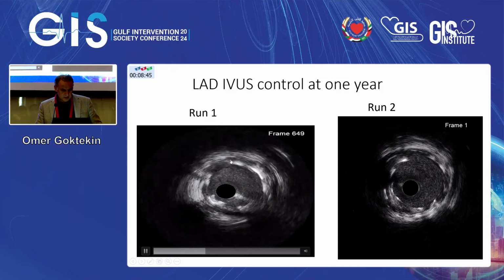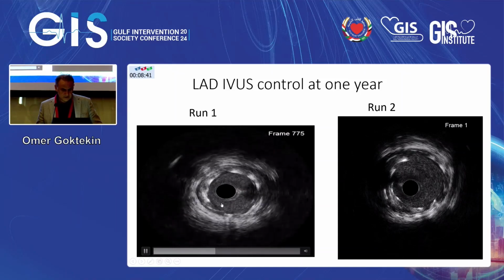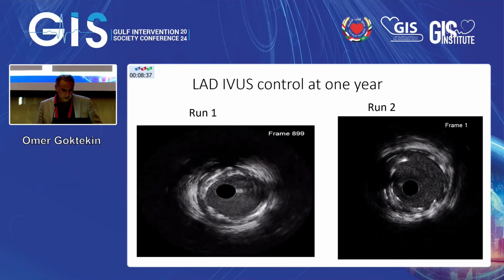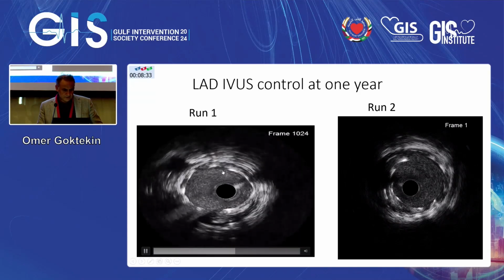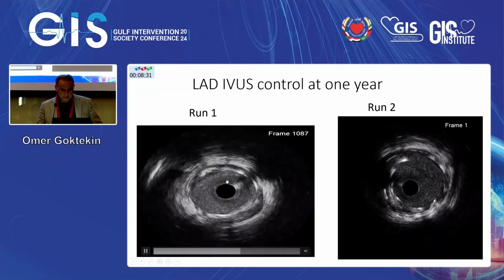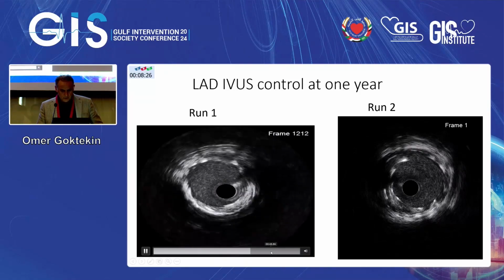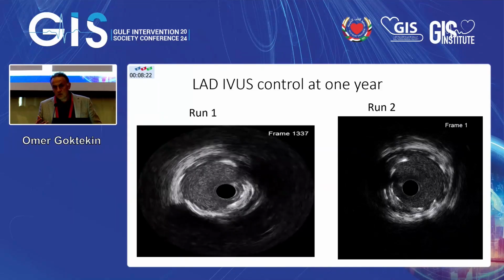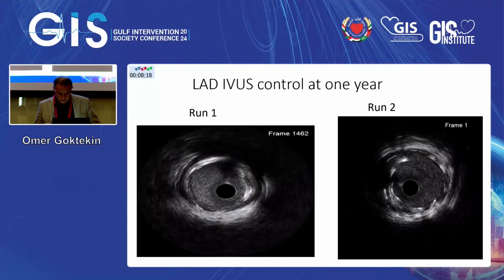You see, we could have some enlargement, and it's obvious on OCT studies and other IVUS studies that we really have enlargement by pulsing. I think the more natural flow we give, especially for RCA also, the bigger the vessel we have, especially during the PCI.